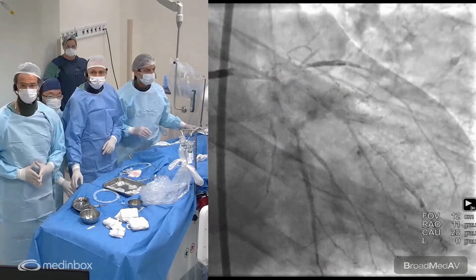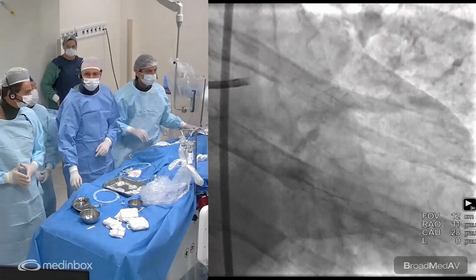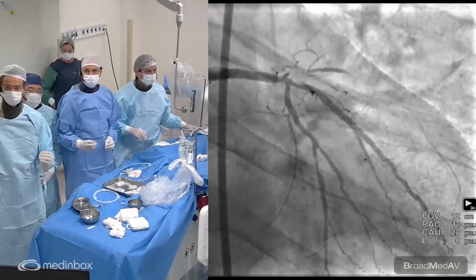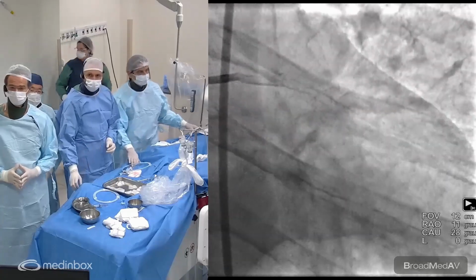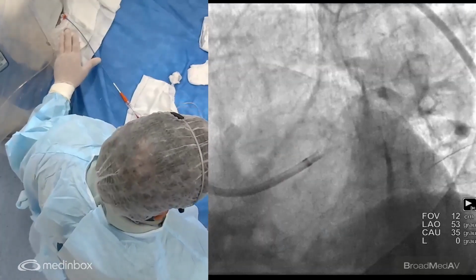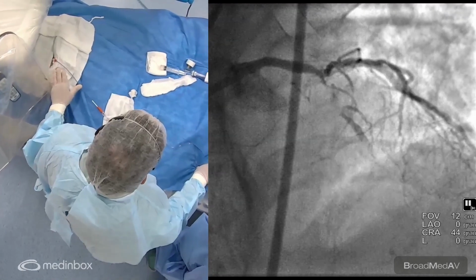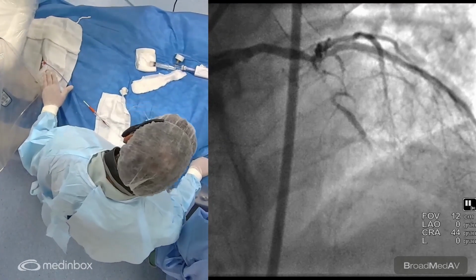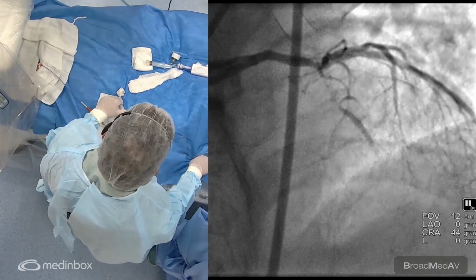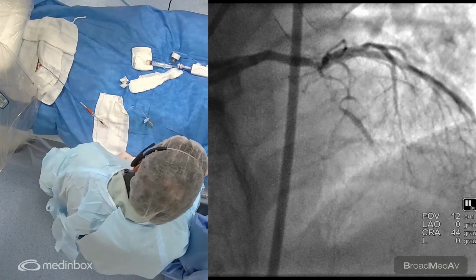Ricardo, that's the first angiogram. So we see again, it's a long left main. It seems to me that there is a bridge collateral there. It looks like a bridging collateral, yes. And here, in the cranial view, I think we can appreciate this better. So I'm going to stop here, go frame by frame. In this view, we can see the bridge and the distal region. Is there any branch involved in the occlusion? Is there like a small diagonal branch over there, Rodolfo? Small diagonal branch?